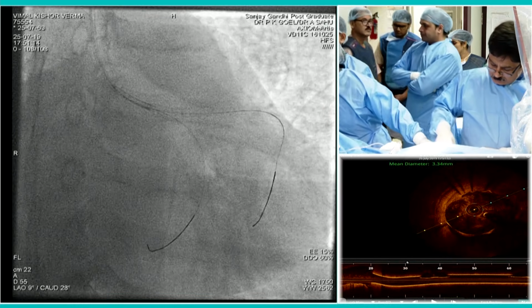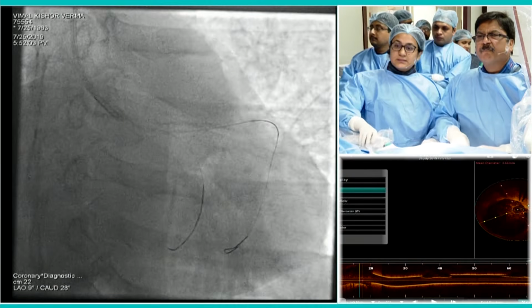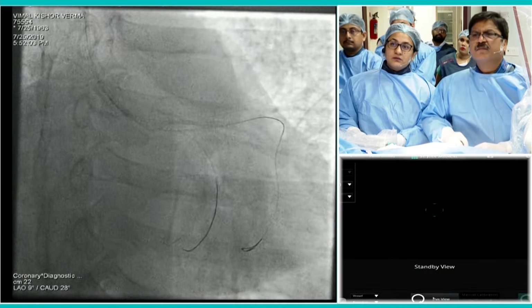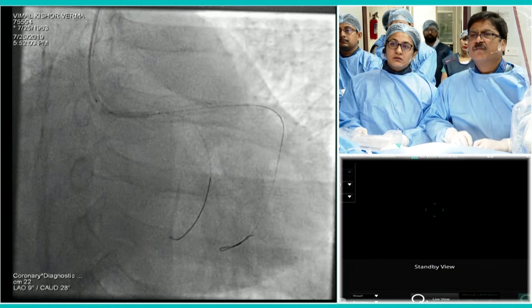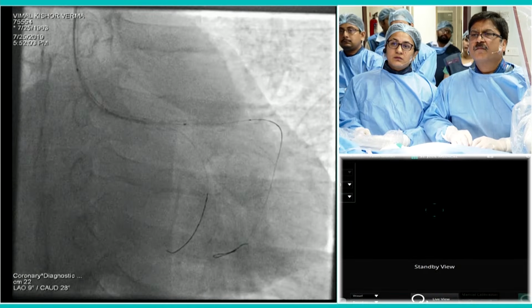Yeah, and I have to say that particularly in the left main setting, where you may need to do the imaging several times, OCT can be a problem, particularly when the patient has some renal failure and so on. But still, it's not a contraindication, of course. It's just a matter of being used to it. But definitely, if you look at the pictures with OCT, well.